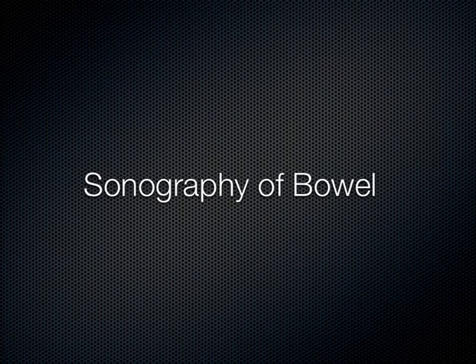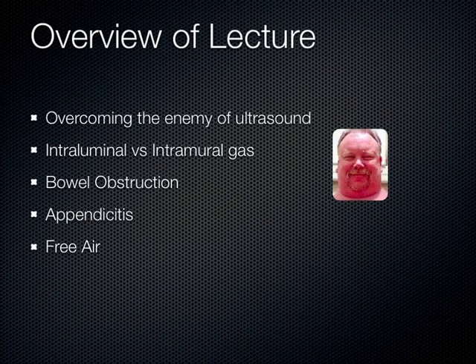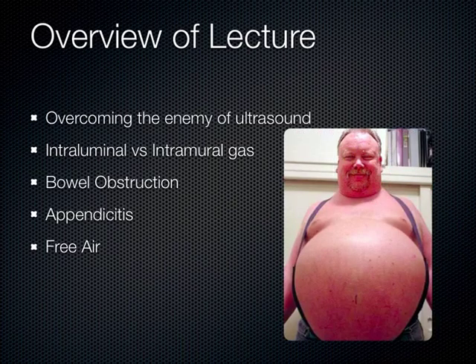Now, you talk about ultrasound of the bowel. Well, first, right off the bat, I know that you know who the enemy of ultrasound is, right? Who's the enemy of ultrasound? Air, bowel gas, generally speaking. And so that's the problem. We have the enemy of ultrasound being the bowel gas, and in some patients, it's pretty significant how much bowel gas they can have, right? So that's why we have to somehow overcome that enemy.